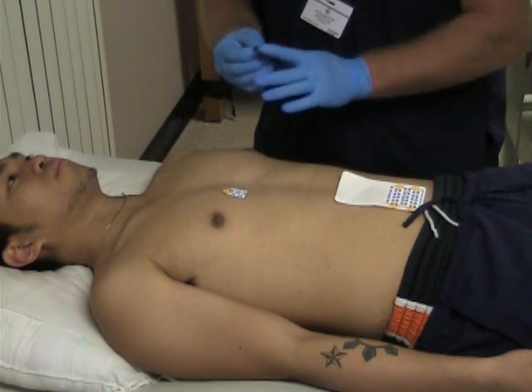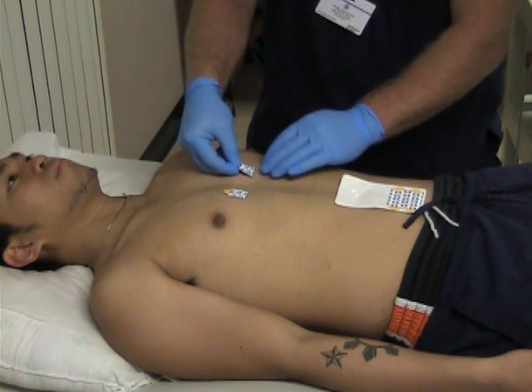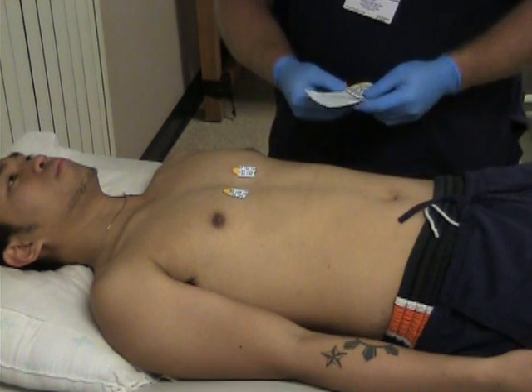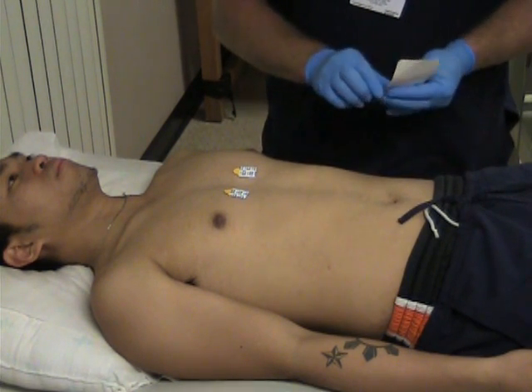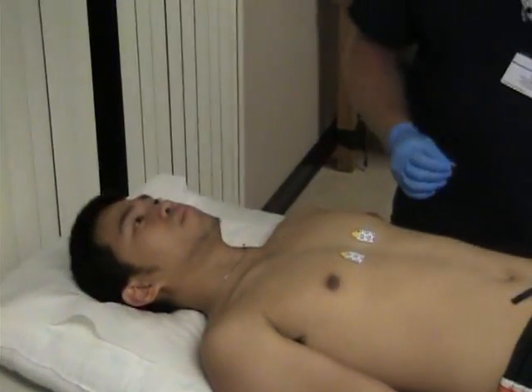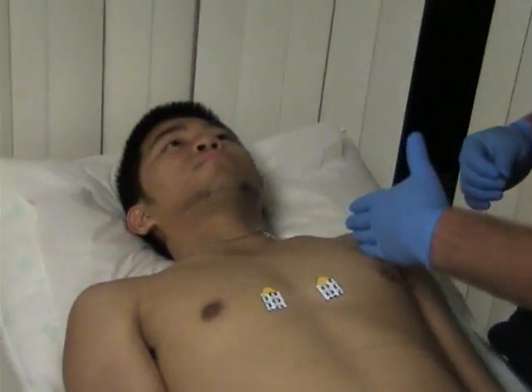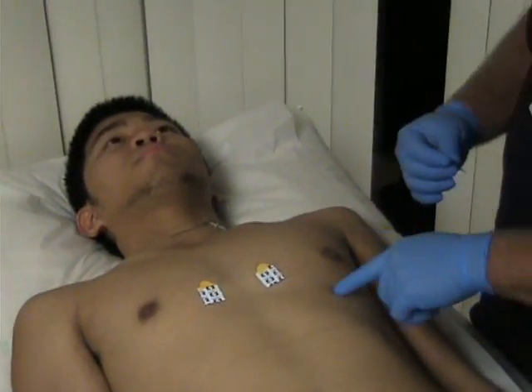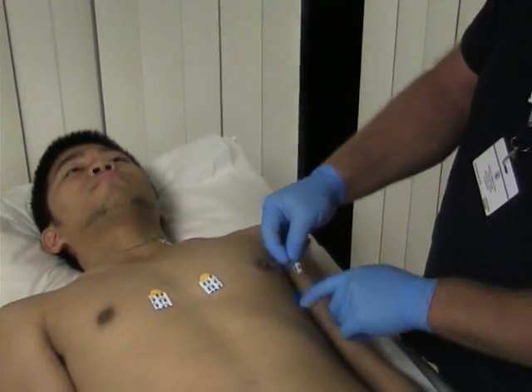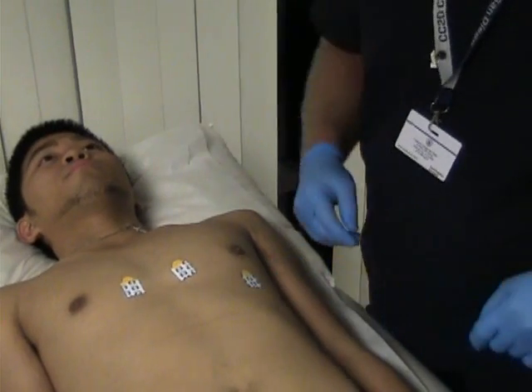We come across to the left side of the sternum at the fourth intercostal space and place our V2 lead. Our next lead will be V4 — we'll skip V3 for now. V4 is a little tricky: we have to find the mid-clavicle point, come down to the fifth intercostal location, and place lead four.